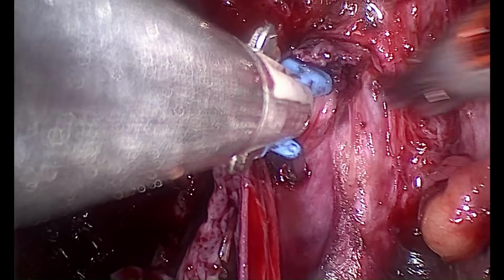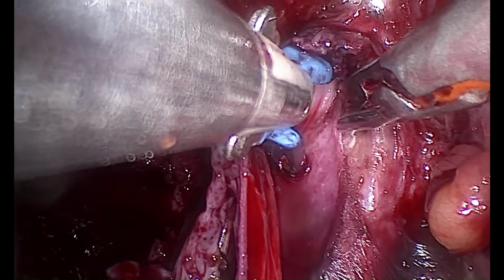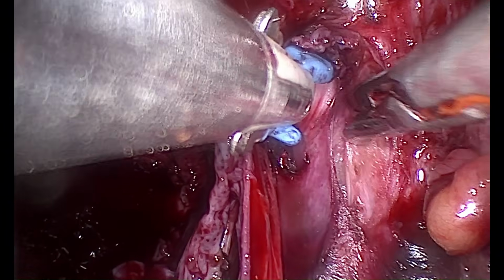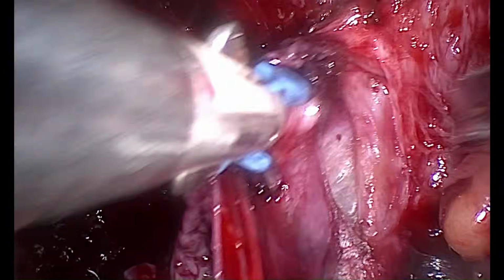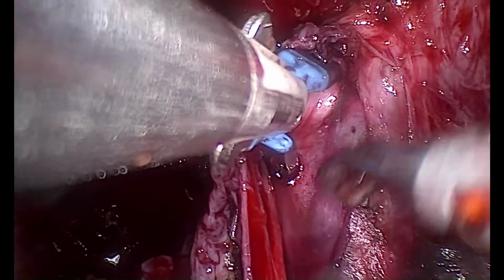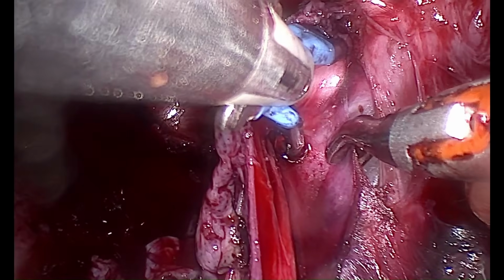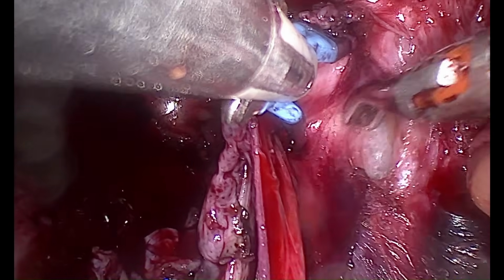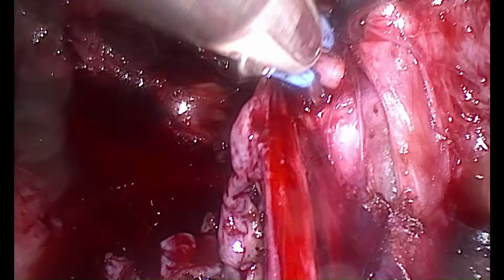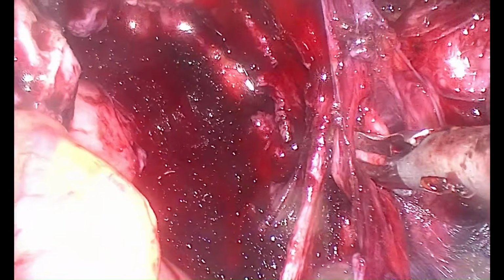The one thing you need to understand is the ureter has a fork, where the lower fork is the uterine vein, and the above is the uterine artery. You can see this is the uterine artery which is going through. So if you are not very keen about the dissection, this usually bleeds in this particular state, and you will have torrential bleeding. So there is what is called water under the bridge.